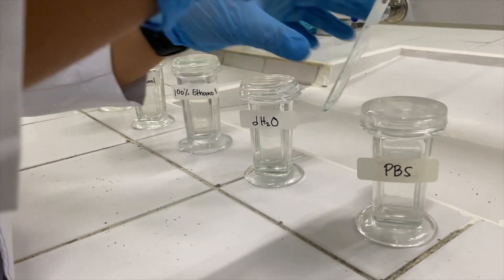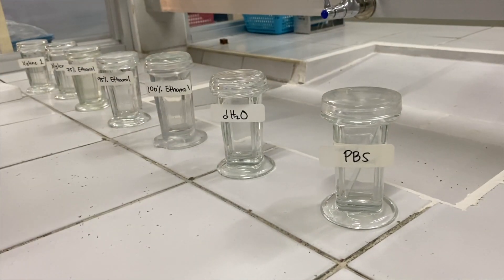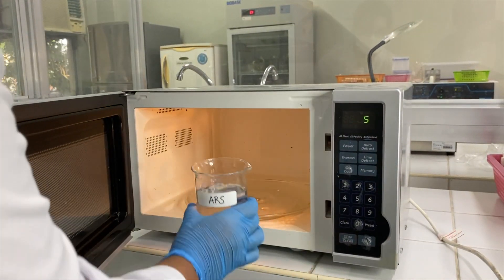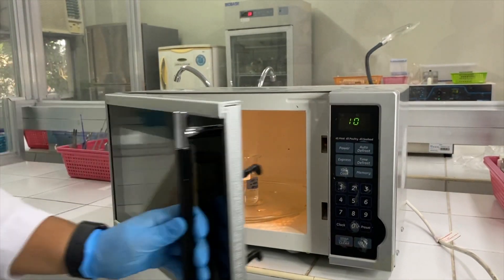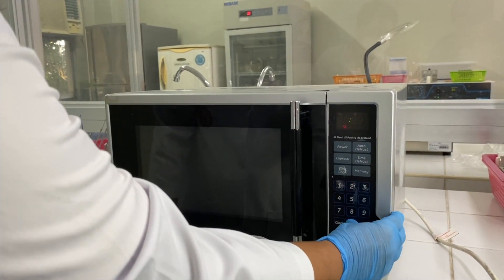Then immerse the slide in phosphate-buffered solution until you are ready to proceed with the next step. While the tissue is immersed in PBS, we need to prepare our antigen retrieval solution by warming it in the microwave for 1 minute. Avoid boiling.